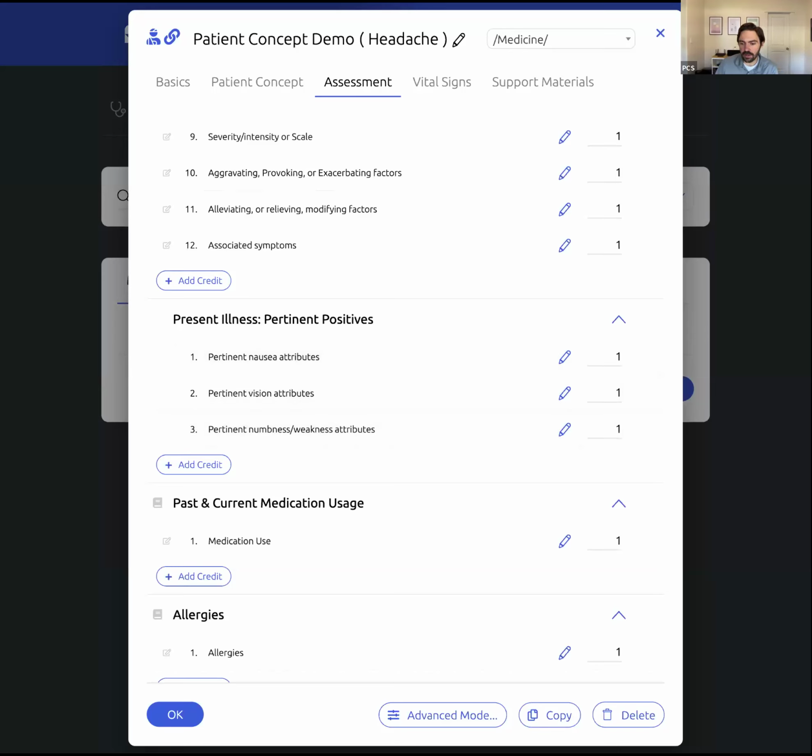Let me, Nick, go ahead. Nick. Can you hear me? This is Marcus. Yeah, Marcus, go ahead. Hey, we had a request for a pediatric scenario. Can you just kind of run through a pediatric patient? Yeah, for sure. Thank you.